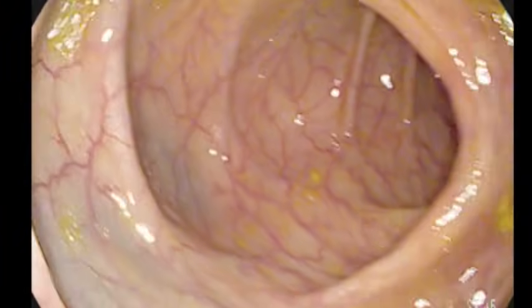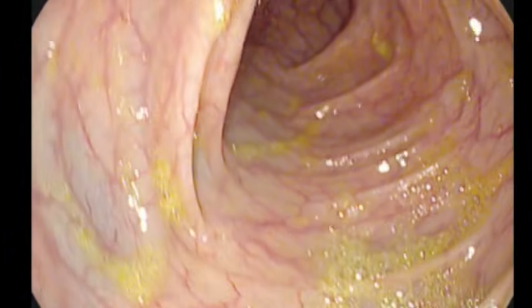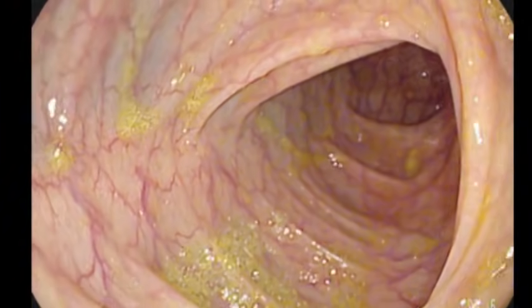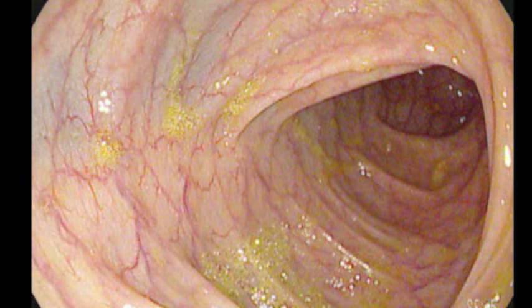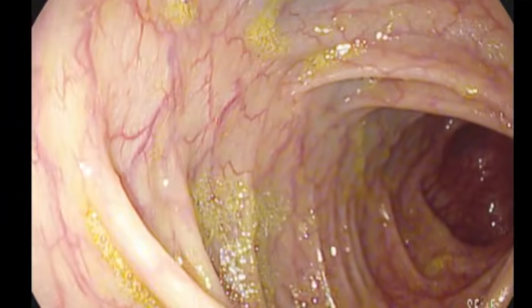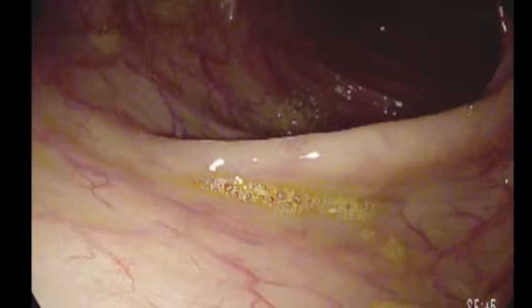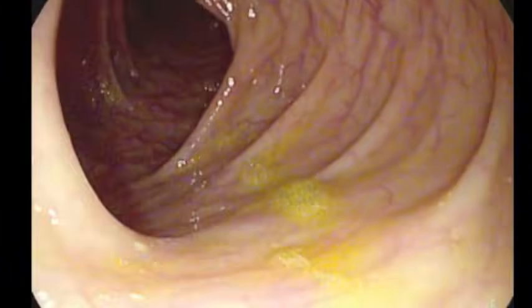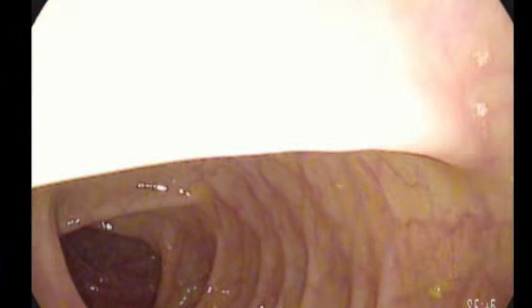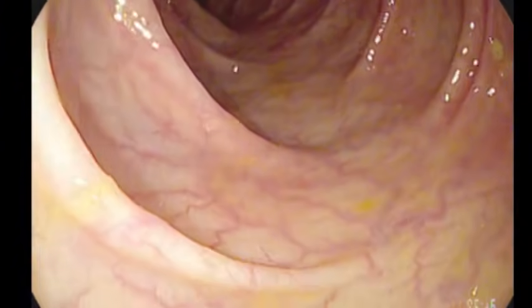As the scope is pulled back through the ascending colon, a faint blue structure appears underneath the colonic mucosa on the left-hand side of the screen. This is the liver. Upon gross observation, the large intestine has a much larger lumen in comparison to the small intestine, and the mucosa lacks villi. A sharp eye will also make out the faint pit pattern, which is also seen in the gastric mucosa and represents the many crypts of the colonic mucosa.